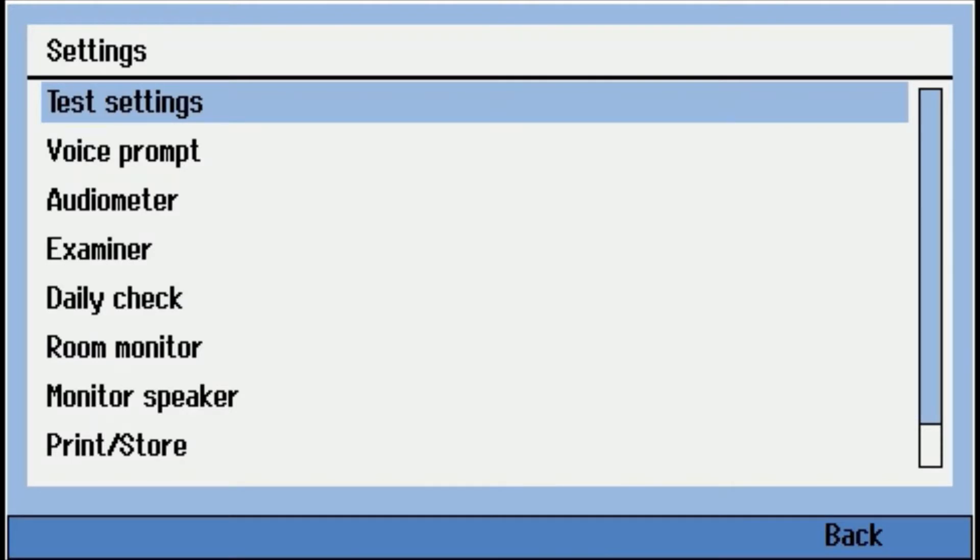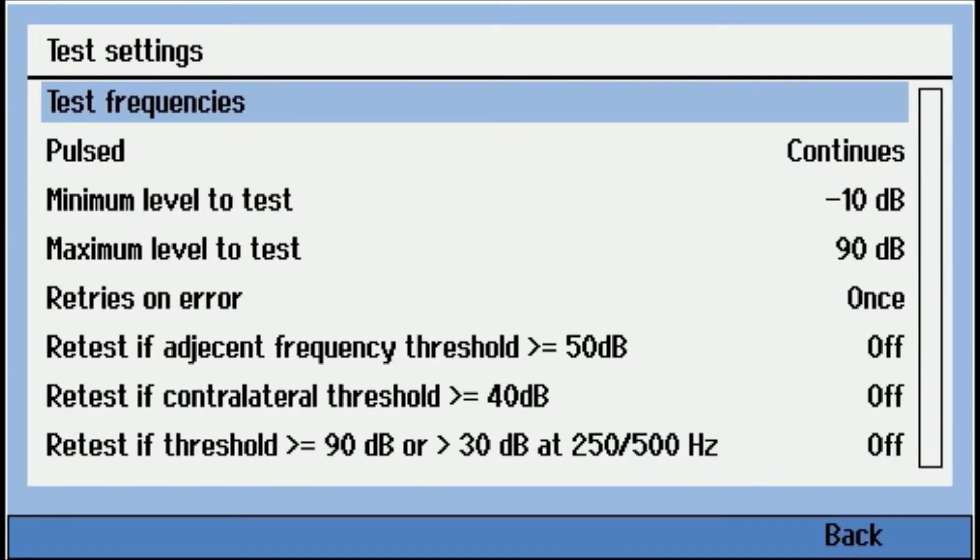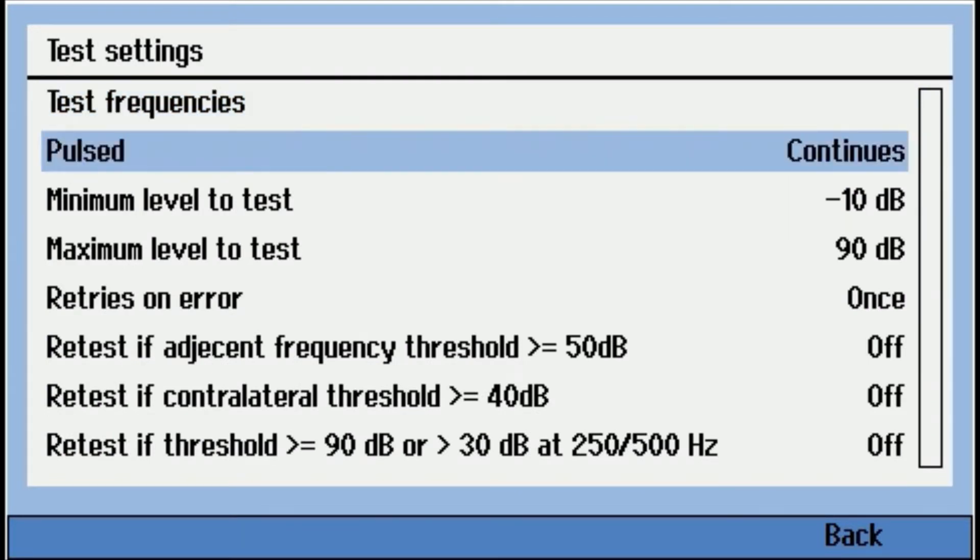Test Settings first. So there's an Enter button, so we hit Enter. You can turn different test frequencies on and off. You can select pulsed to continuous tone, minimum test level, maximum, retries on error. So this is how many times can somebody have a hand switch error before it's going to pause the test.